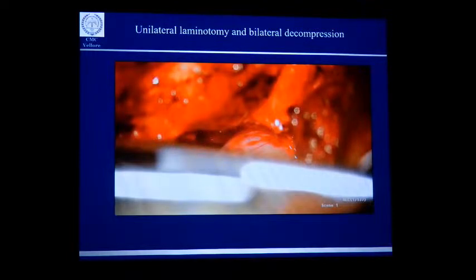So two things you have to watch here: you have to do all the bony decompression before you start removing the ligamentum flavum, so that your drill is not hitting the thecal sac. Next, you have to undercut the spinous process so that you get more space to go to the other side. Once that is done, you get adequate space. You can tilt the patient, which will improve your view of the opposite root.